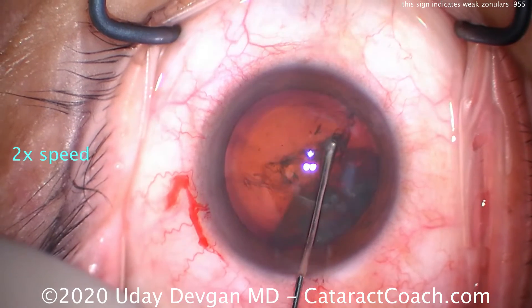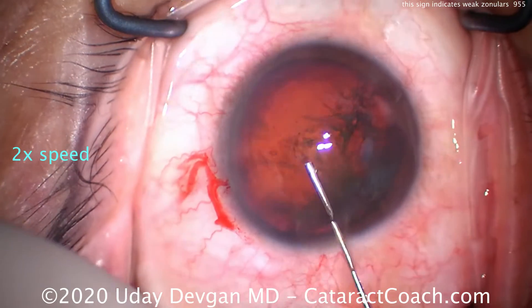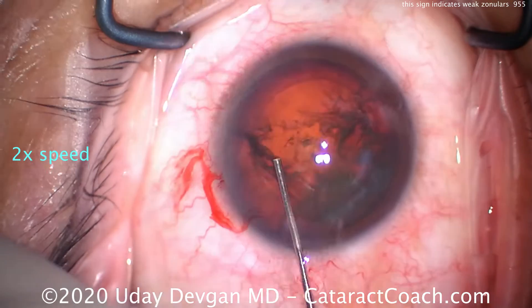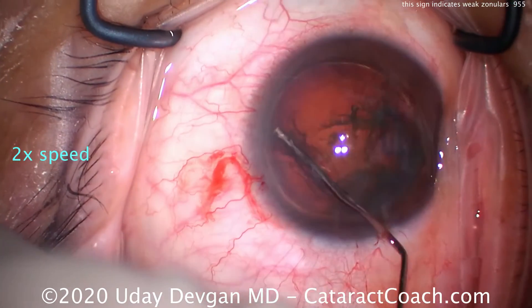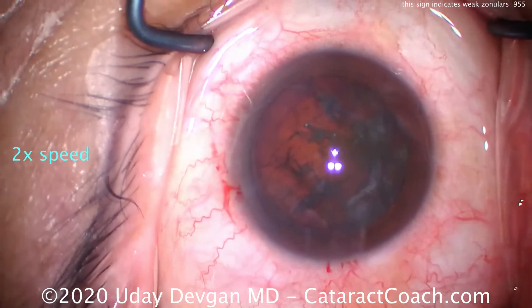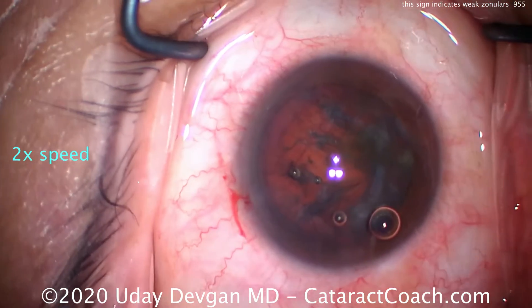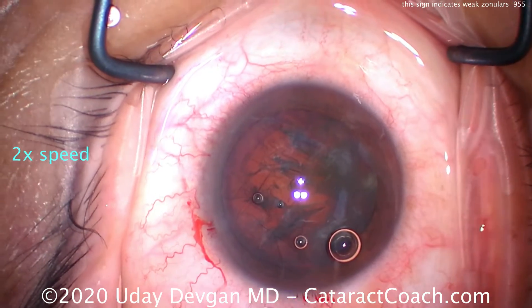We're going to speed up the video to get through all of it. Nice and easy on the hydrodissection — you can see we touch the center of the nucleus and it seems a little weak. We do a hydrodelineation, spinning the nucleus, and put more viscoelastic to recoat the endothelium.